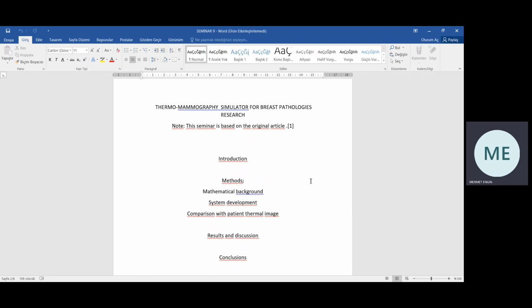This model will be a phantom of a woman's thorax of ectomorph complexion with an electrical actuator within hydrogel. Therefore, it is possible to simulate thermal breast pathologies by integrating a thermovisual control system in the electrical actuator inside the medium, with physical features comparable with mammary gland characteristics.